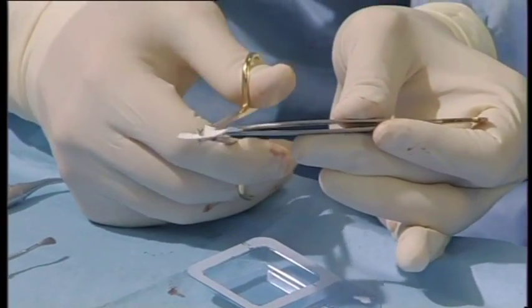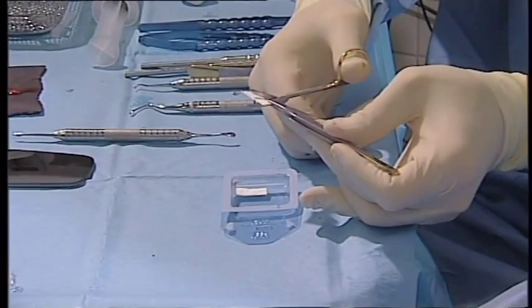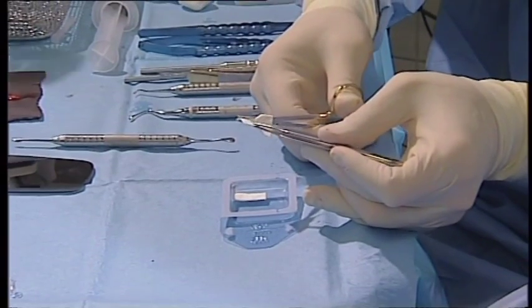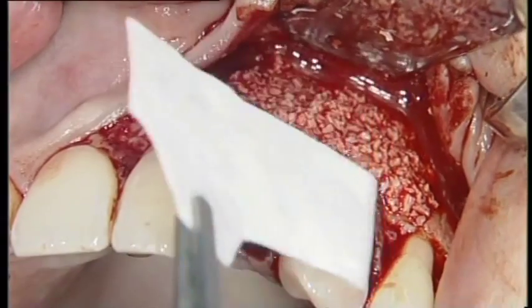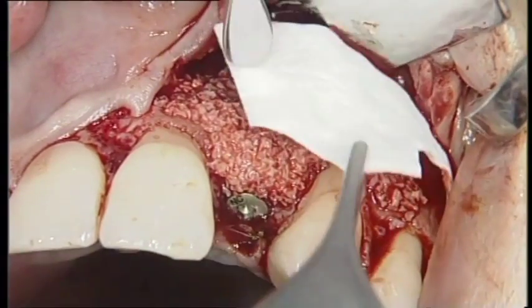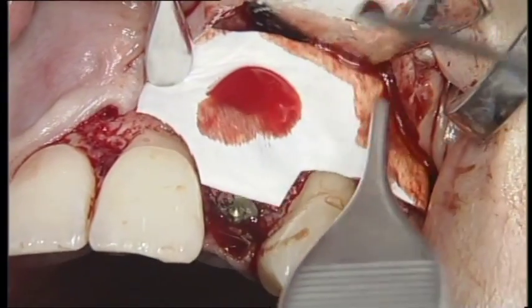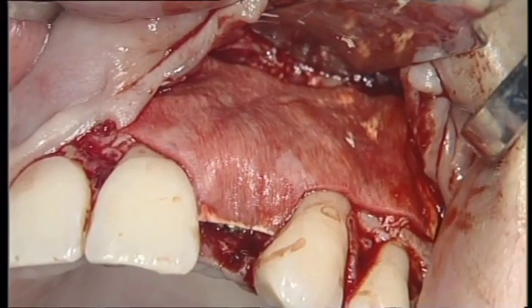A resorbable non-cross-linked collagen membrane is cut into 2 pieces, a larger and a smaller one. The larger strip is trimmed to the required shape. This membrane strip is put in place over the grafted site. The membrane extends to the canine site as well. Blood is delivered onto the membrane with a syringe. Once the membrane is soaked with blood, it becomes soft and is easily adaptable.